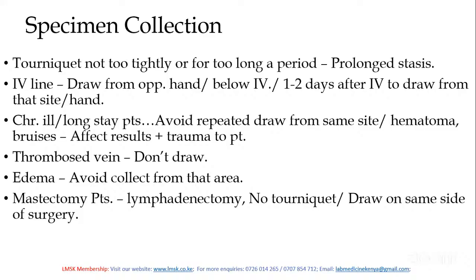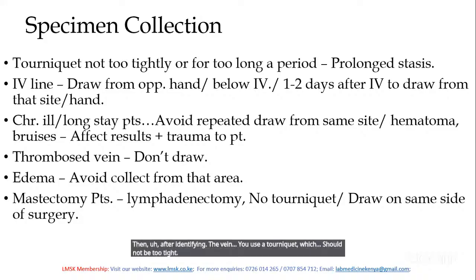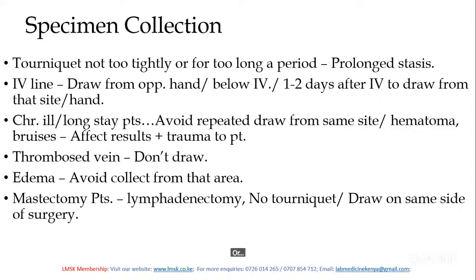Then after identifying the vein, you use a tourniquet, which should not be too tight or stay on for too long.